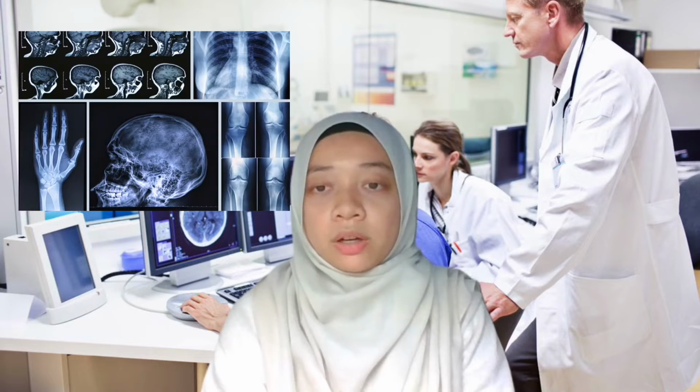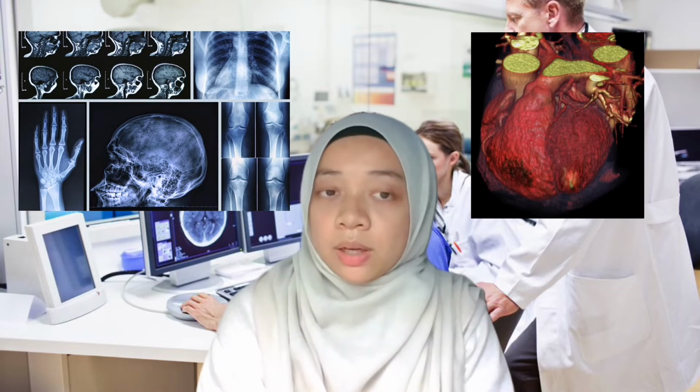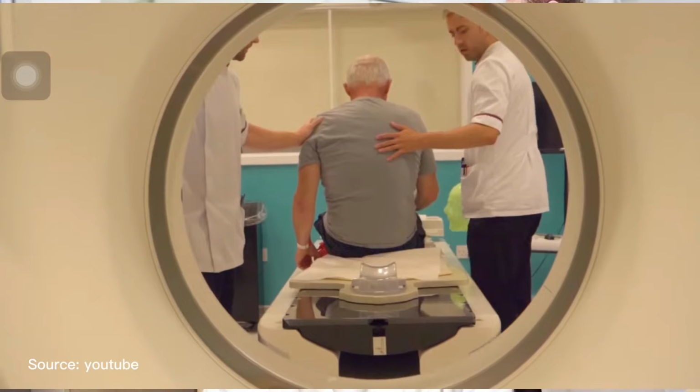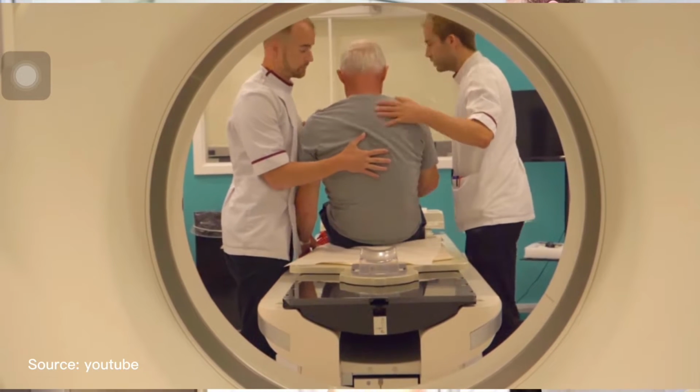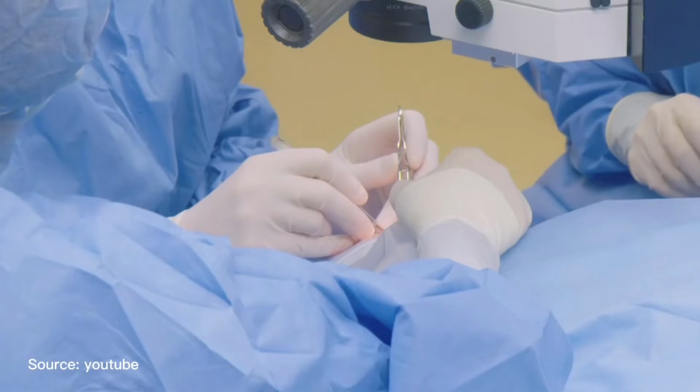So, to simplify, Dicom is used for digital data exchange and interchange among electronic devices used in medical imaging. However, it only speaks to the behavior of devices used in PACS.